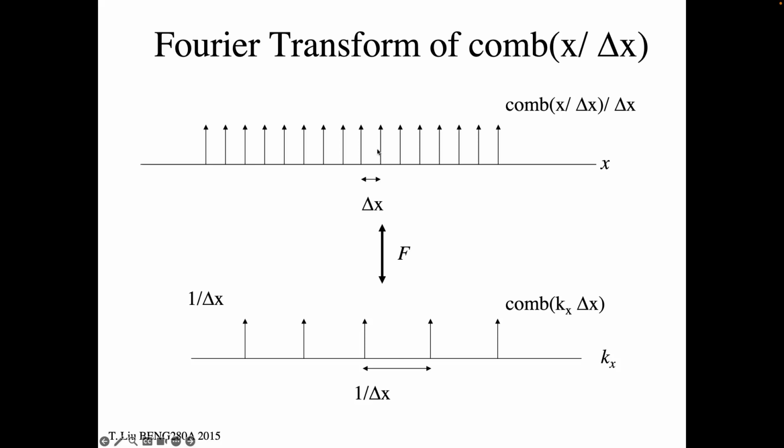So as these get closer together, what does that mean? When I push these samples closer together by making delta x smaller, say I take my CT detector that had a delta x of 1 millimeter between each detector element, and I now build a new detector that has 0.5 millimeter, so I squish everything in by a factor of 2, then the Fourier transform of that comb function, these will spread out farther, right? The replicants of these delta functions in Fourier space.